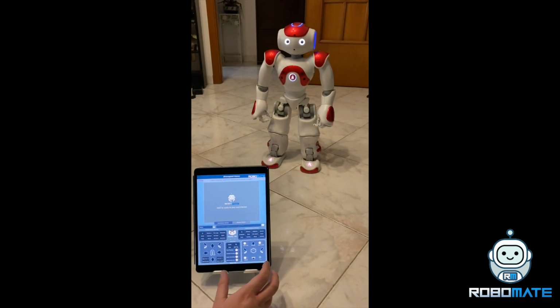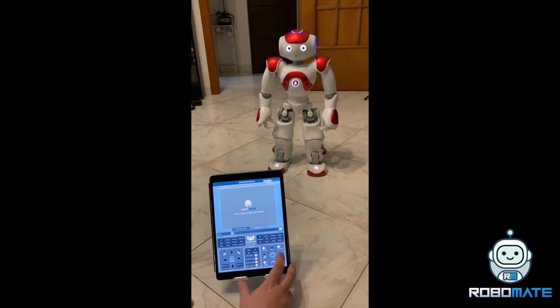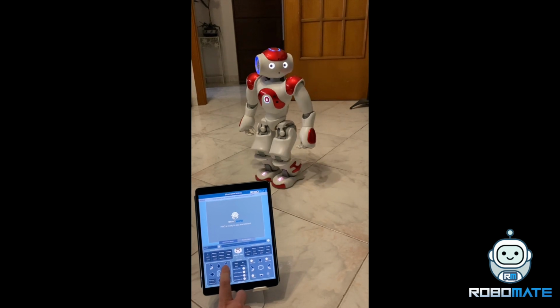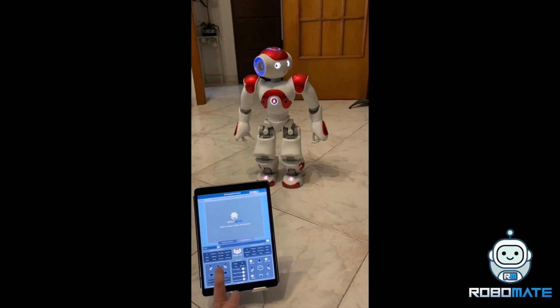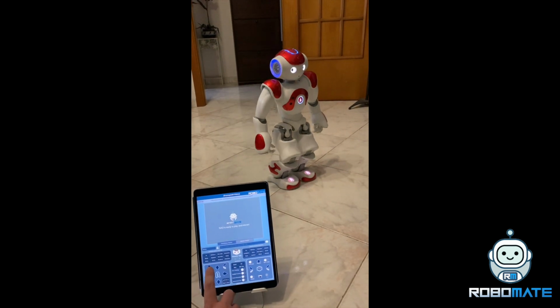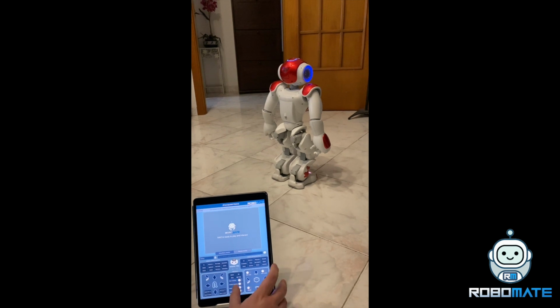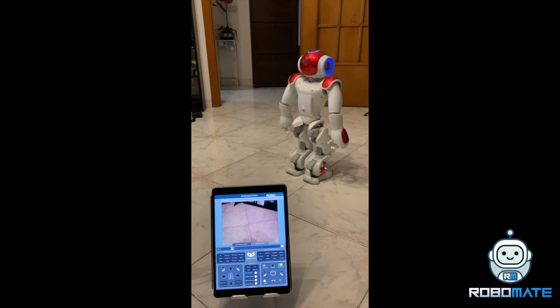In remote control, I can control the robot during the exercise by moving and rotating the robot to the position we want. So in this case, I will move the robot in this way and switch on the streaming camera of the robot in real time.